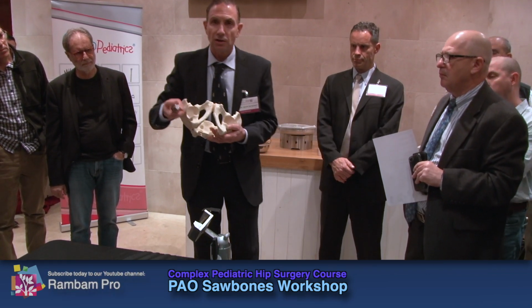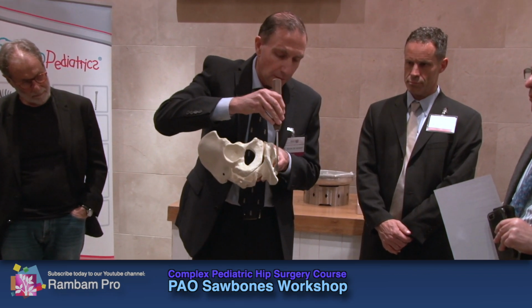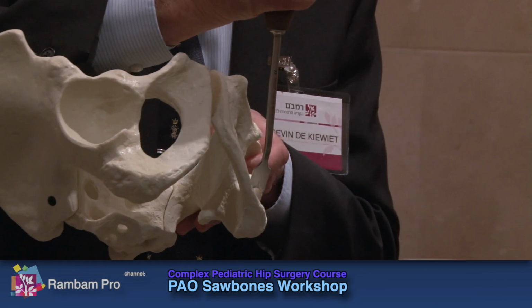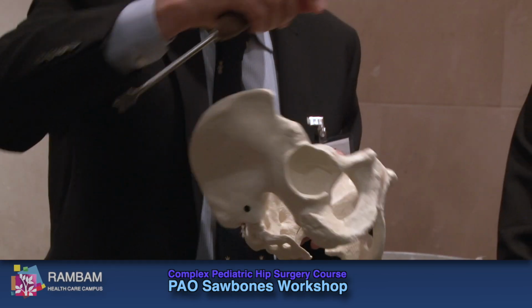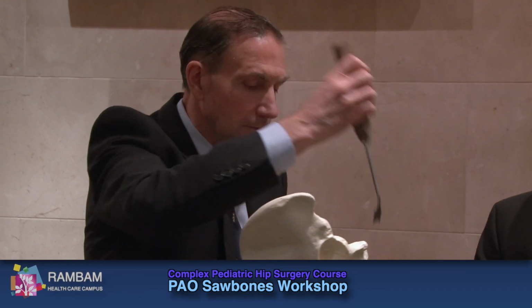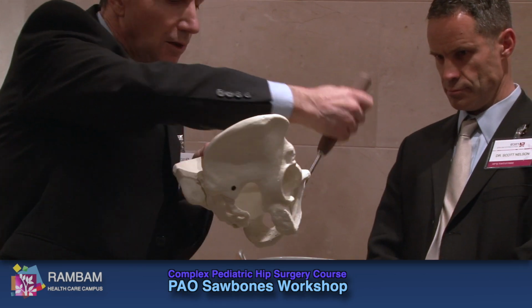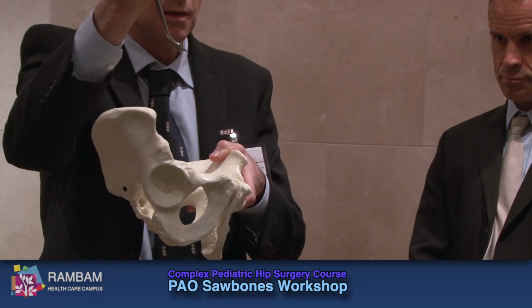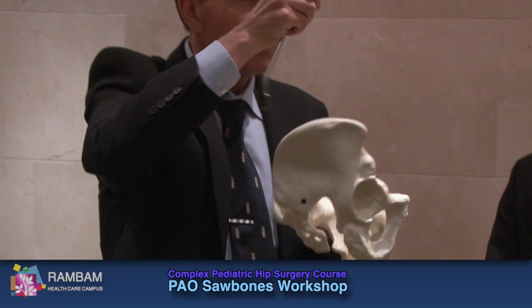And this is a partial osteotomy. So you can feel this like that. The starting point is going to be with the handle almost vertical. And as you do the osteotomy, your hand will drift inferiorly like this, so you go up underneath the acetabulum towards the lesser spine. You still see that? Towards the lesser spine. So you will rotate your X-ray picture, your machine will go this direction, right? And then come back towards the patient. So what you're then seeing is that spine in profile.